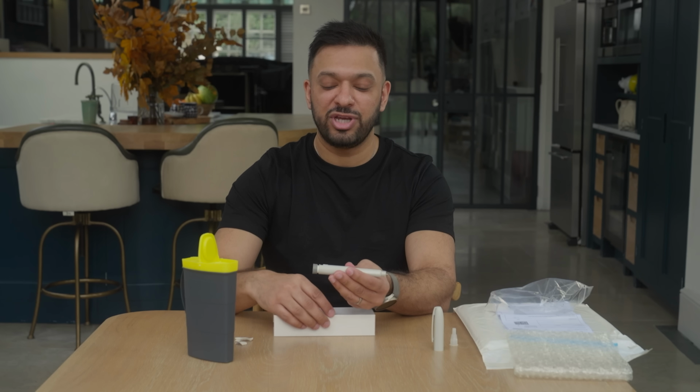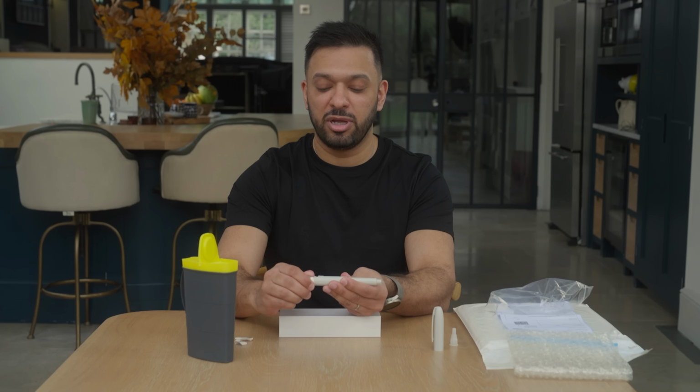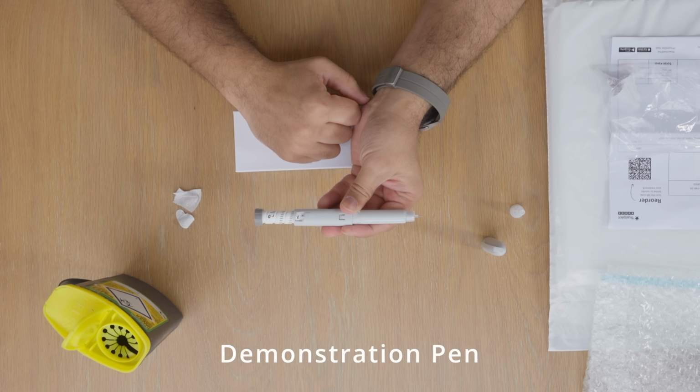When you are ready to inject, twist the plunger all the way until the number 1 appears in the treatment window. You are now ready to inject. Choose your injection site. Injections can be administered into the front of the thigh, into the abdomen, or into the top of the arm. Care must be taken not to inject into a muscle.